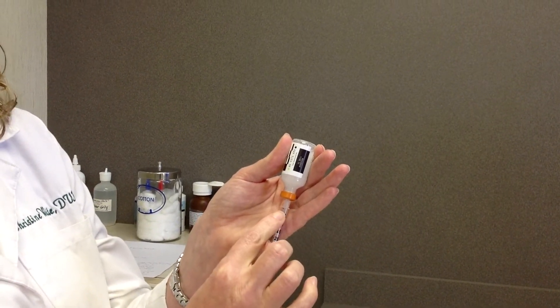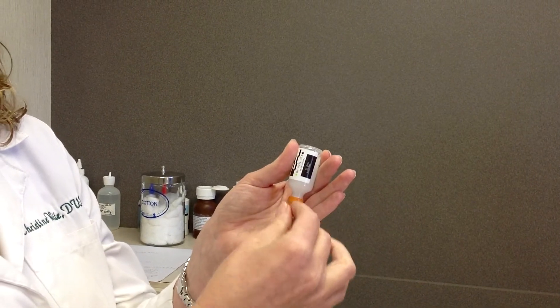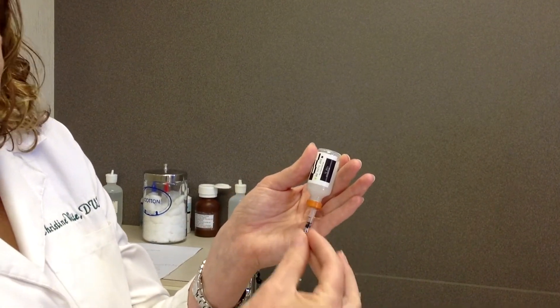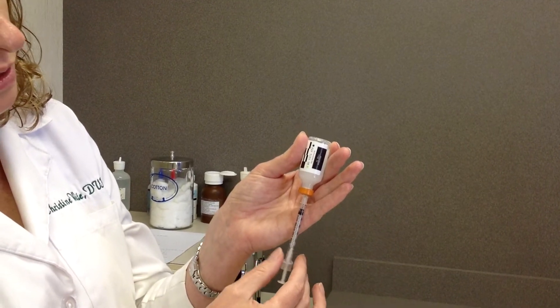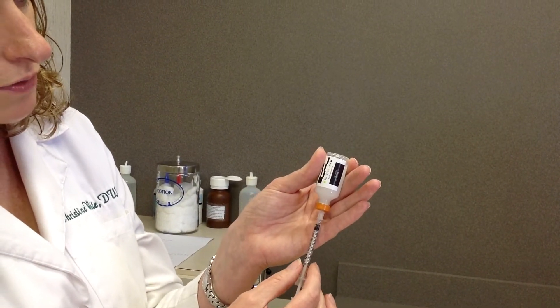If you get an air bubble in the syringe, it's completely fine to just draw down more and then inject back into the bottle to get the dose that you need. Again, there are three units of insulin to give to Wiley.